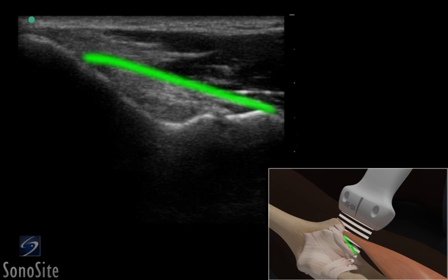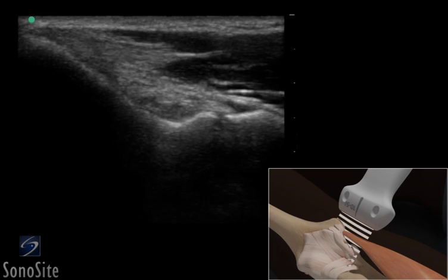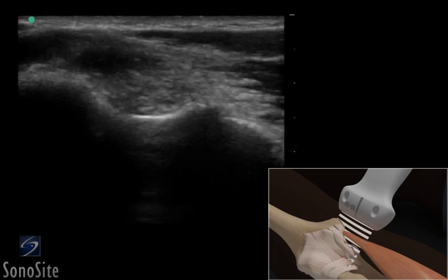The anterior bundle of the medial collateral ligament can be seen as a thin hyperechoic band that runs between the medial epicondyle and the ulna. Dynamic scanning with valgus stress can be used to evaluate the medial collateral ligament for laxity or injuries.